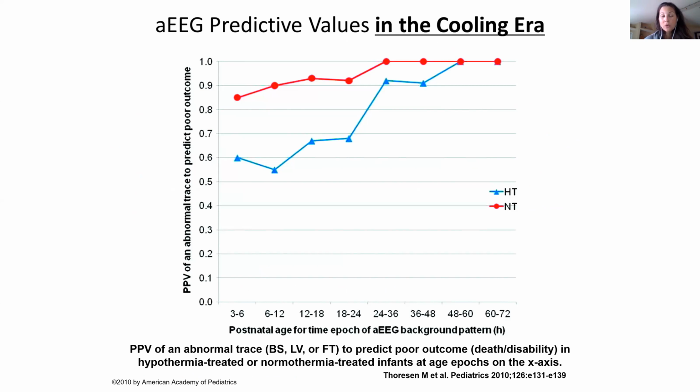So they took the TOBY trial kiddos, some who were being cooled, some who were not, and they looked at how predictive aEEG is. Can we still use it? Well, look at the cooling babies. These are the blue lines. This is the positive predictive value.